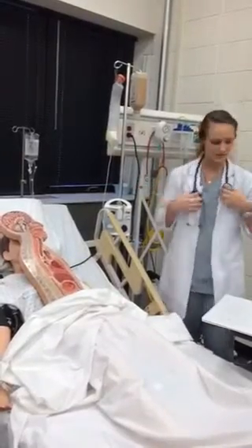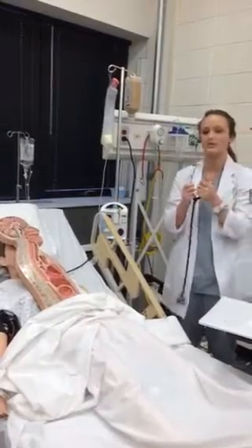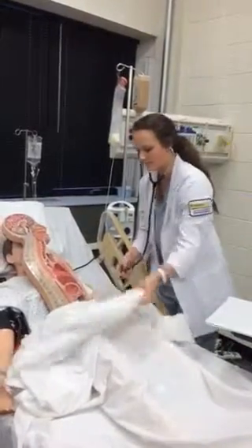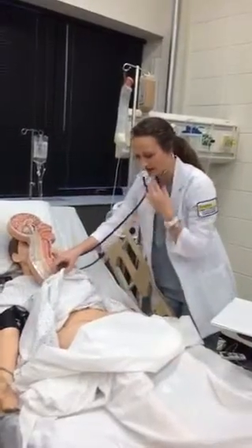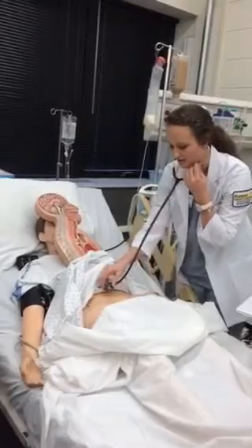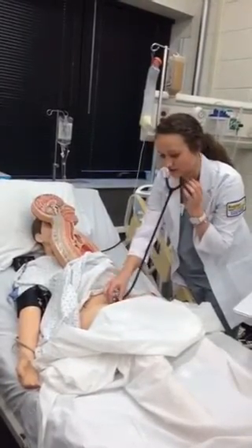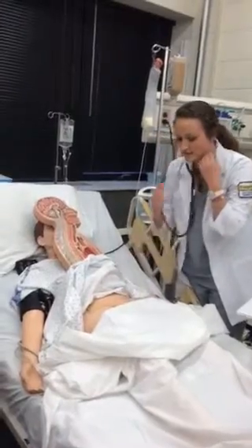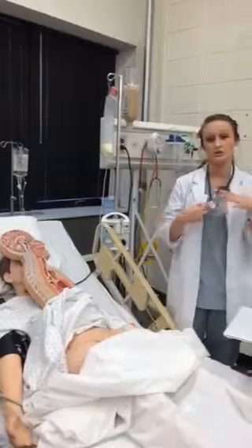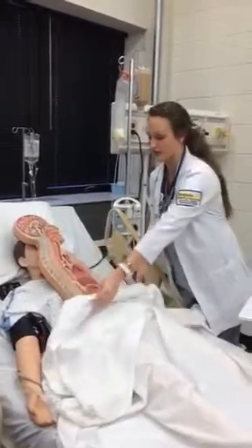So once I have my supplies and everything and the patient knows what's going on, I'll assess the abdomen. So I'll look at it, make sure everything looks okay, no distension. Then I'll listen. Make sure I hear bowel sounds in all 4 quadrants. And I'll listen for 2 minutes in each quadrant. If I don't hear anything in either of the quadrants, then I'll listen for a full 5 minutes.